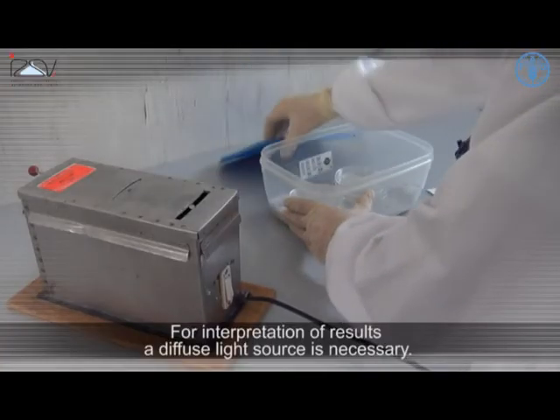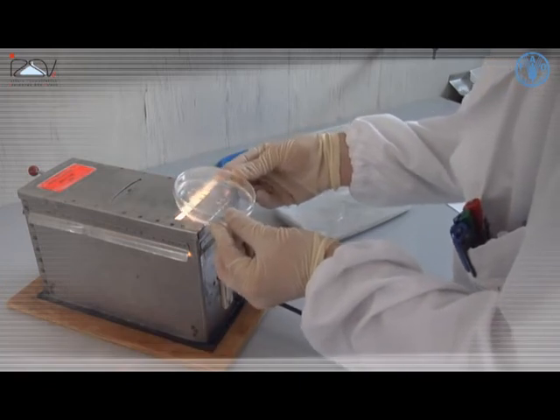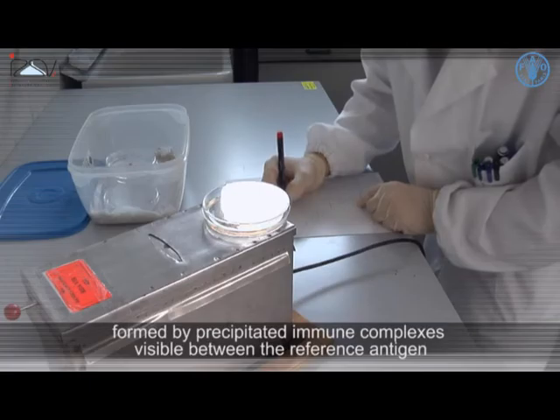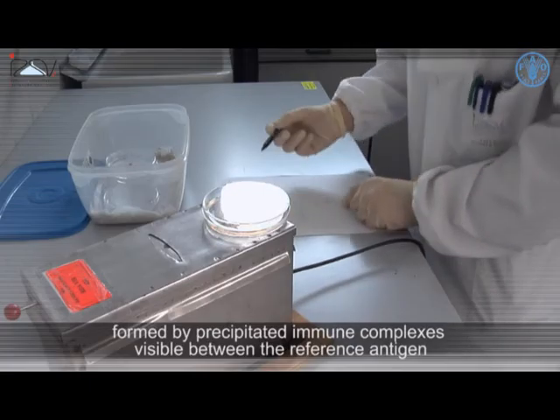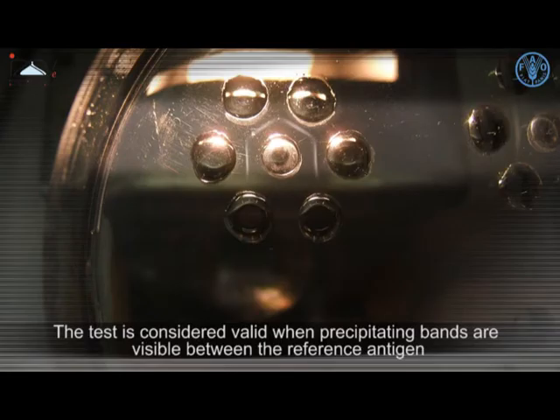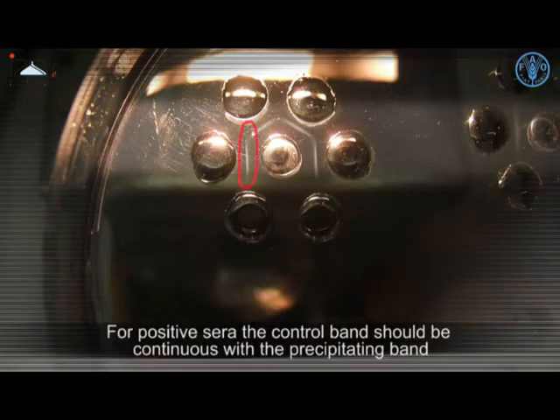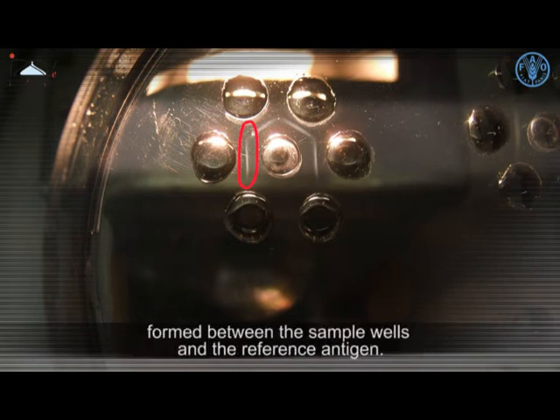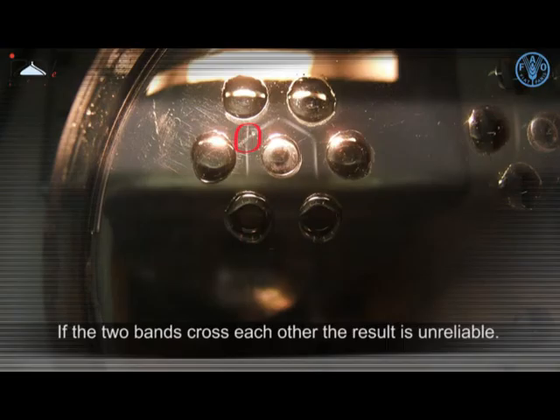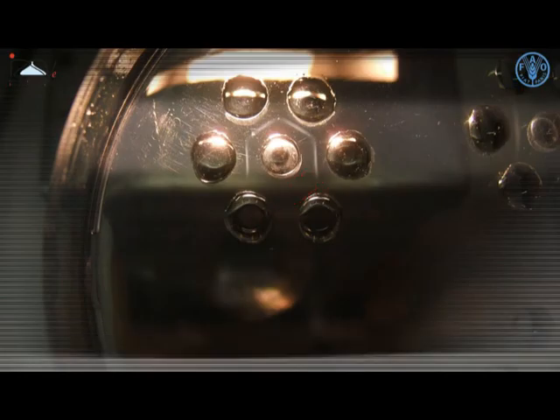For interpretation of results, a diffuse light source is necessary. Illuminate the Petri dish from below. Antibodies against influenza A viruses are detectable by the presence of bands formed by precipitated immune complexes visible between the reference antigen and the antibodies in the serum under examination. The test is considered valid when precipitating bands are visible between the reference antigen and the positive control serum. For positive serum, the control band should be continuous with the precipitating band formed between the sample wells and the reference antigen. If the two bands cross each other, the result is unreliable. For negative sera, the precipitating bands should not be present.